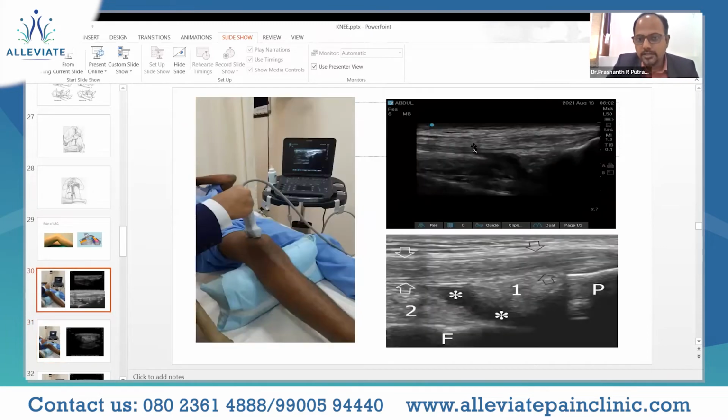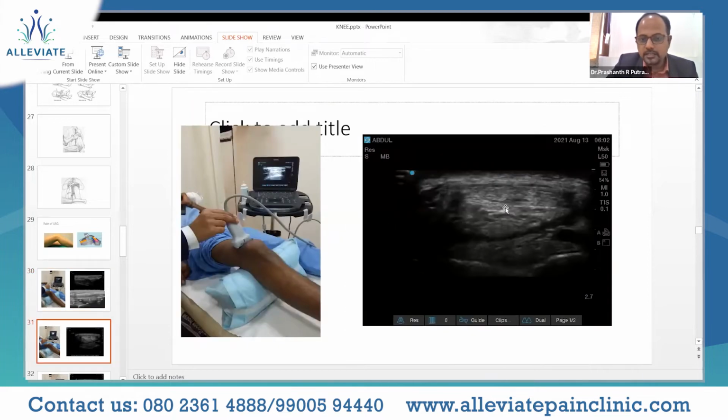As you can see over here, you have the tendon. As you move proximally, you reach the musculotendinous portion of that muscle. And here again is the suprapatellar recess, which is a very important landmark for us because of the various interventions we do in the knee joint.